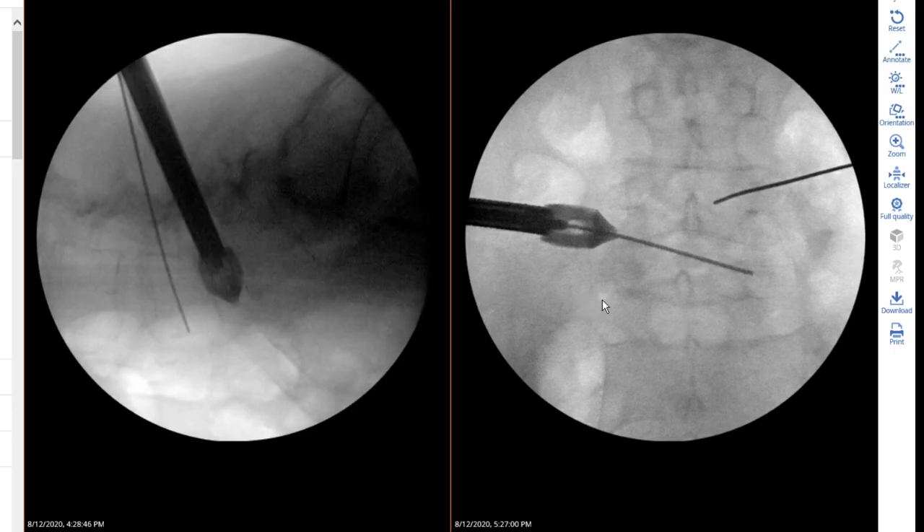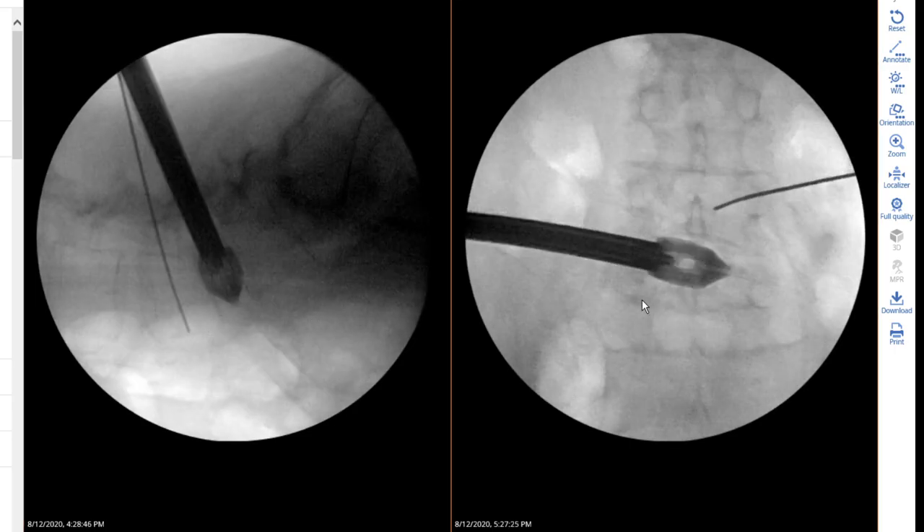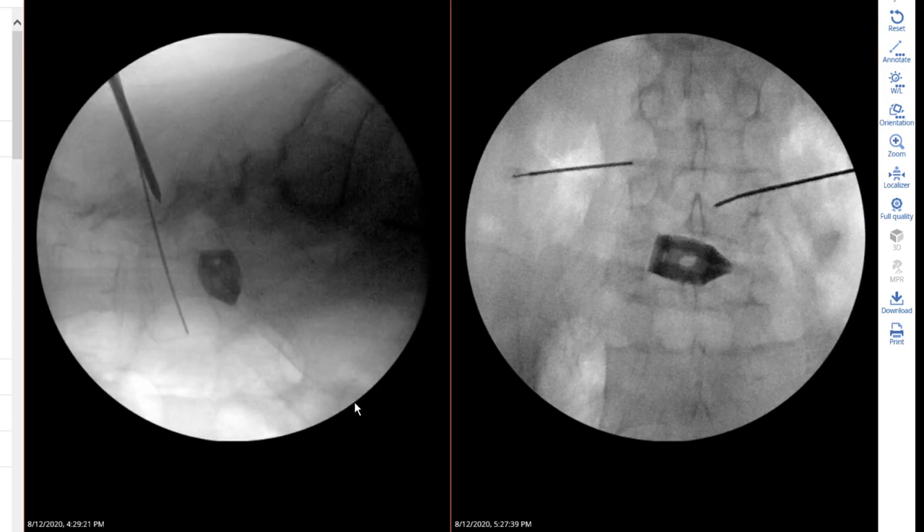Remember we started the surgery at 4:20, and here it is 4:28 — already the cage is in place.